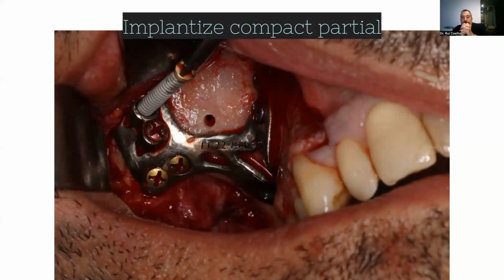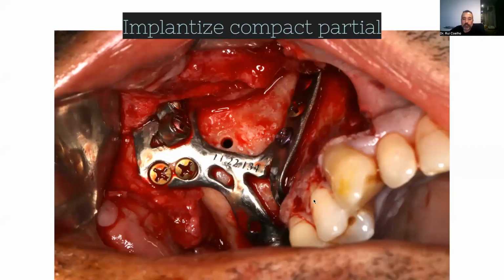And also, in some cases, you can avoid doing a sinus lift, or there are sometimes problems with sinus lift cases, and we can even do it for cases where we have to avoid, for some reason, we don't have bone, just missing two or one teeth, and we can do it without making grafts of the sinus, for whatever reason. Okay. So you can see it here.